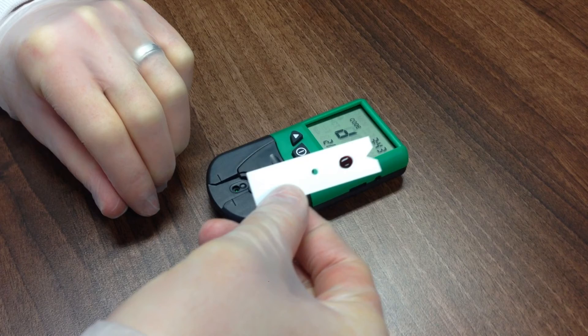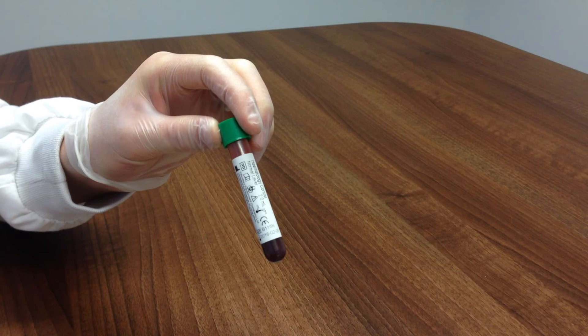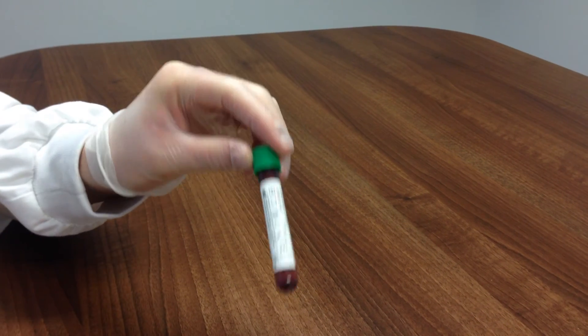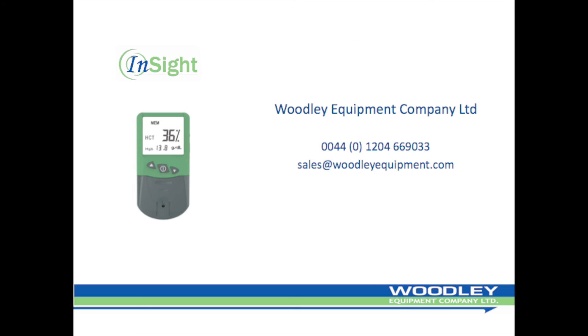The meter will automatically turn off after two minutes of inactivity, or can be turned off manually by pressing the power key. Follow the same procedure to run a QC sample, using one drop of QC and ensuring the cap is replaced promptly and tightly. The QC should be mixed gently before using, and if it hasn't been used for a while, dispose of the first one to two drops of liquid. Please refer to the strip label for the QC target range.